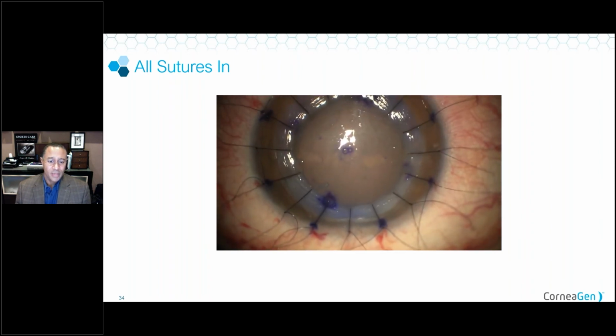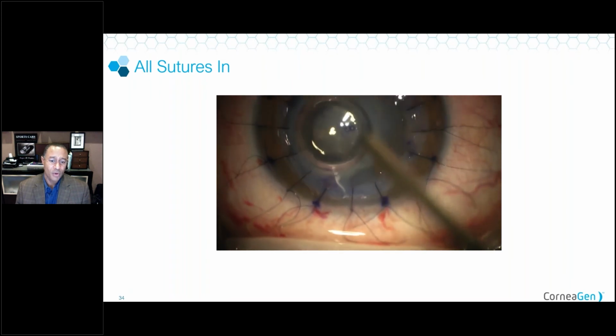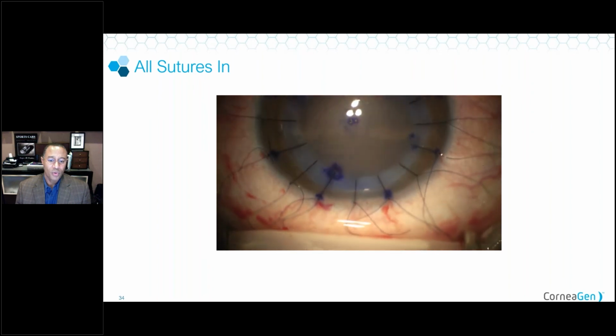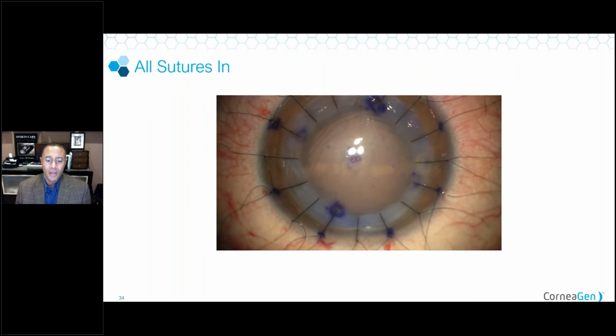Here, as I zoom in, you'll see some wrinkles on the superior part, or really inferior part of the cornea, superior part of your view here. You'll see some wrinkles in the peripheral cornea. That's happening because we've now shortened the arc length on the posterior stroma, and that posterior stroma will wrinkle. It can be concerning at first, but ultimately those wrinkles will iron themselves out as edema and things resolve and as the donor heals to the recipient. Next slide.